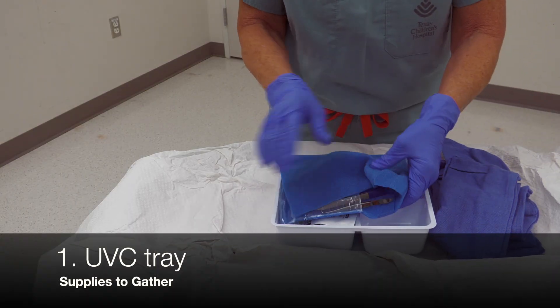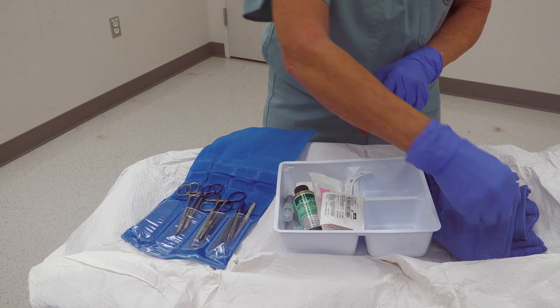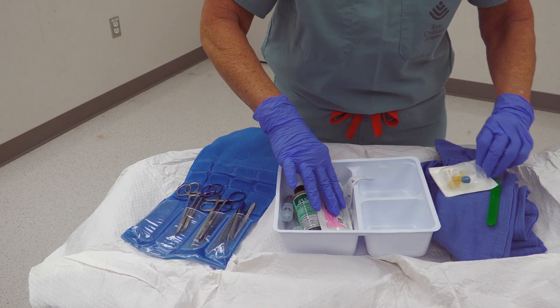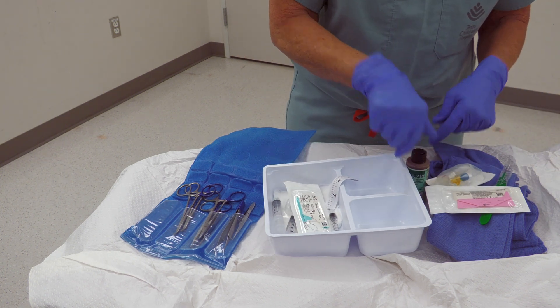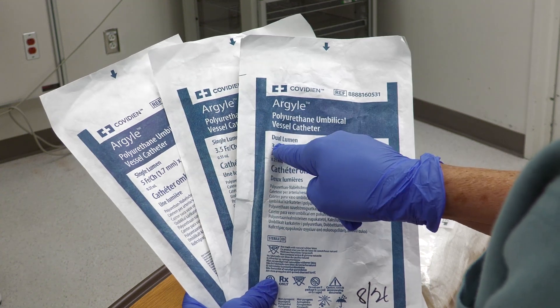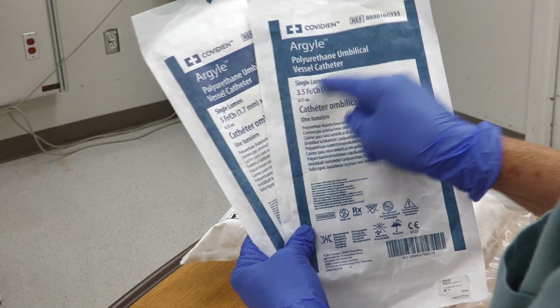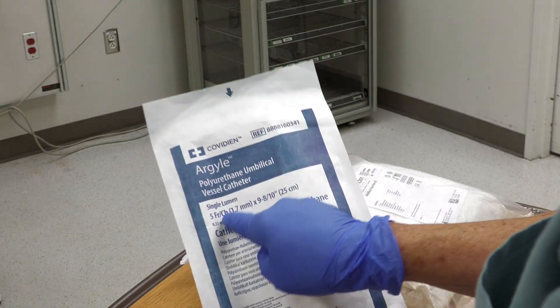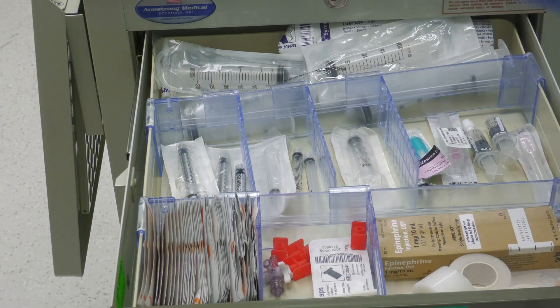The UVC tray has all the equipment you need to place the umbilical catheter. Specifically, it has a scalpel, a stopcock, an umbilical tie, and betadine or another antiseptic. The UVC catheter in this situation is for emergency use, so a single lumen should be chosen to reduce preparation time. The catheter sizes can be either 3.5 French or 5 French. The sterile normal saline can be gathered in 10 mL pre-filled syringes.